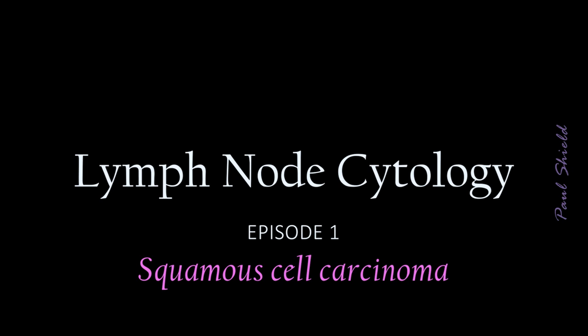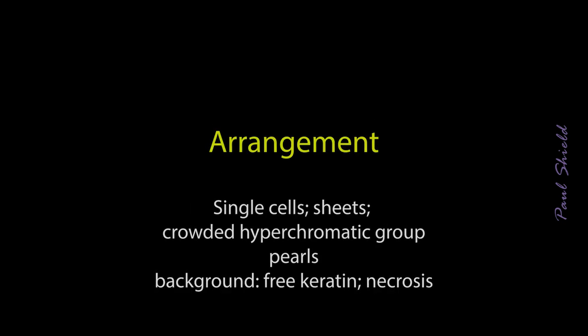Hi, it's Paul. Let's look at squamous cell carcinoma and its generalised features in cytology specimens. So we'll look at the usual features and how they're expressed in SCCs. Arrangement, like in the cervix, is usually single cells, flat sheets of cells, or crowded hyperchromatic groups of cells. Also, pearls. And often you'll have a background that has a combination of necrotic debris and free keratin.